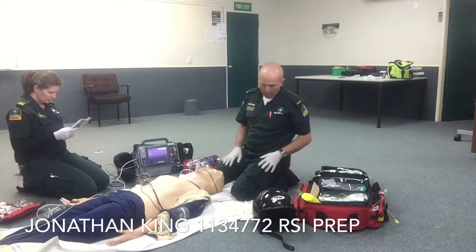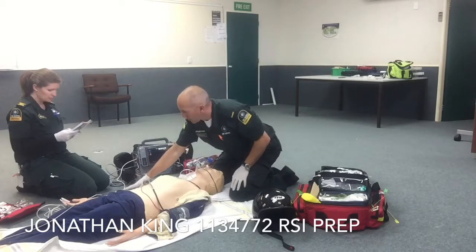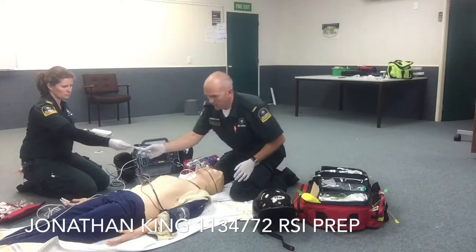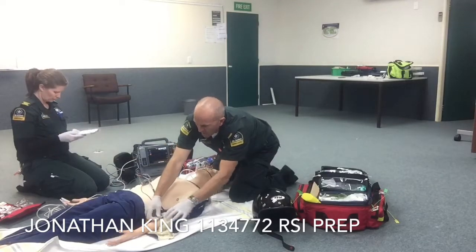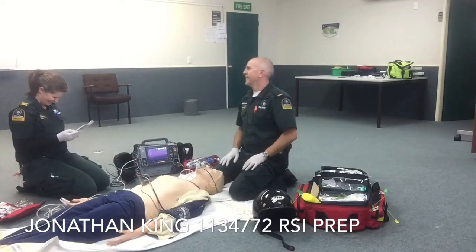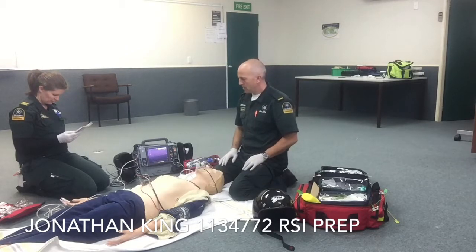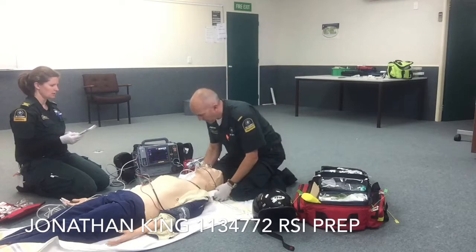Gain IV access, preferably in 2 sites. Okay, do that. We're going to get another one here. Yep, thank you. Prepare a running line of sodium chloride. Yep. Done. So we've got that line running. Position the patient for optimal airway control. For example, consider placing a folded towel under the head. Folded towel is under the head.